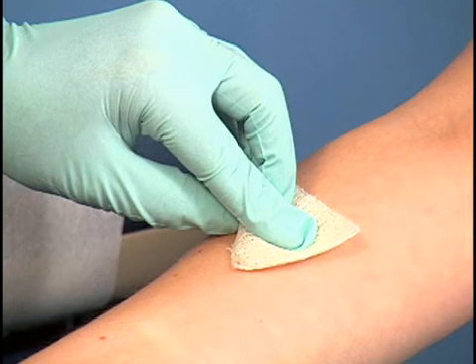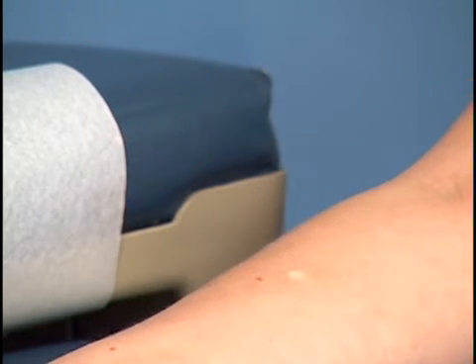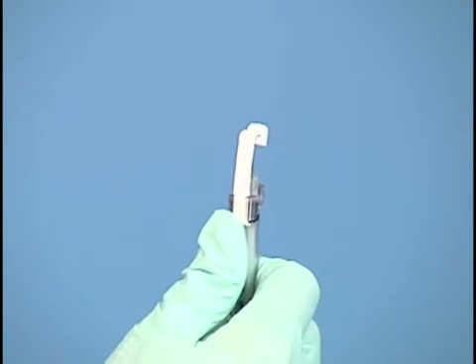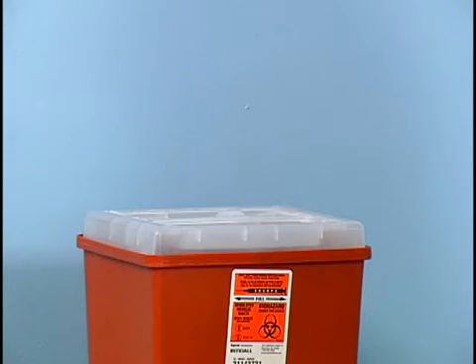Applying pressure may cause leakage of the testing solution through the needle puncture site, resulting in inaccurate test results. If blood appears at the puncture site, it is not significant and will not interfere with the test results. Activate the safety shield on the needle. Properly dispose of the needle and syringe in a biohazard sharps container.